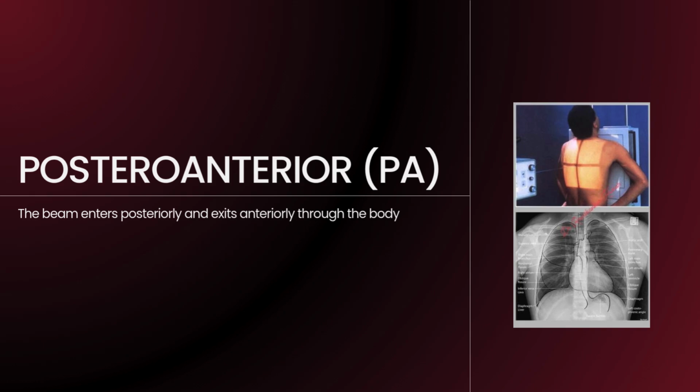So another way I can explain this for you to understand is in this manner. That is, wherever the X-ray beam faces is what starts the terminology. For instance, you can see from this picture that the X-ray beam is facing the back of the patient.